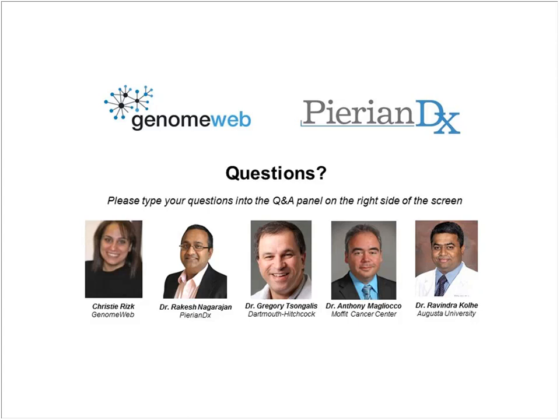However, there's no question there's a significant clinical value to these tests, and we see significant evidence being able to identify patients for approved therapies like anti-BRAF treatments in melanoma, tyrosine kinase inhibitors, and now for immuno-oncology treatments. These tests clearly have value in identifying patients for approved usage of approved therapeutics. So I don't doubt that there will be more evidence accumulating and that these tests will become standard of care down the road. Ravi, can you weigh in? I fully agree with Tony, and as he said, definitely it adds value to the clinical decision making, but the cost benefit has to be determined locally within the institutes or within your practice.